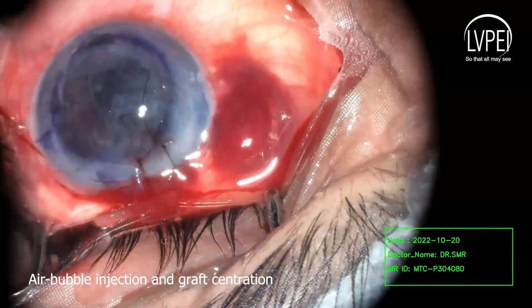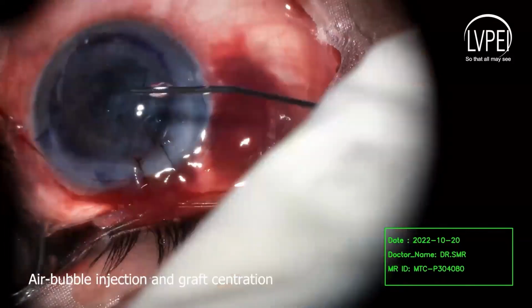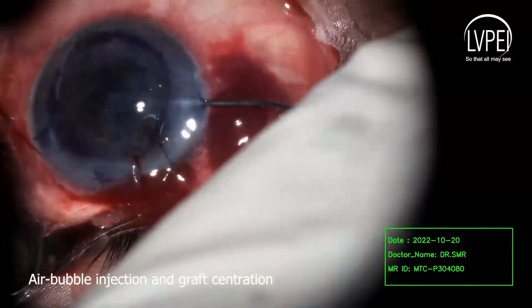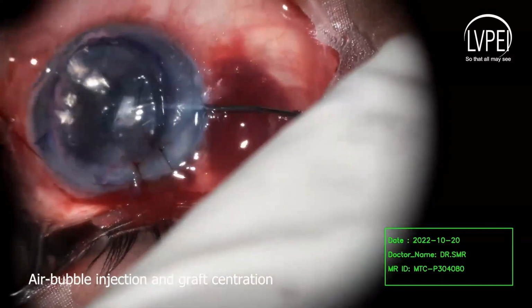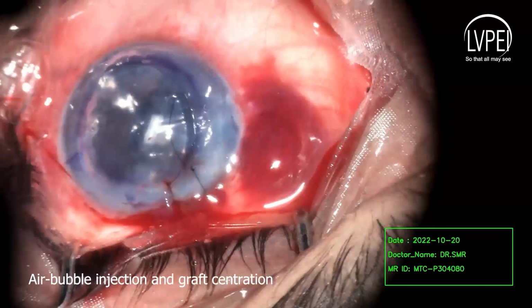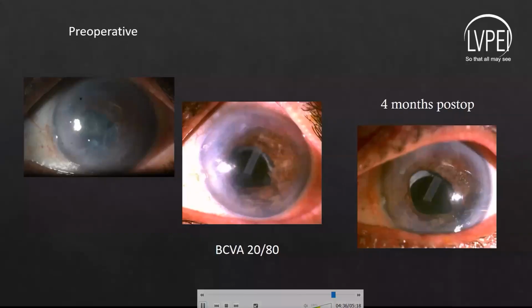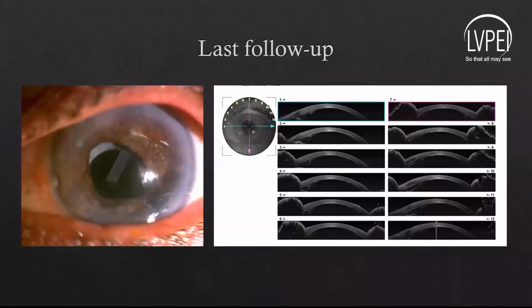The lenticule was centered and secured to the host bed by injecting a full chamber air bubble. Finally, the side ports were sutured. Postoperatively at 4 months, the cornea cleared up well. Vision improved to 20/50 and AS-OCT showed a well-attached lenticule, showcasing a successful DSEK.